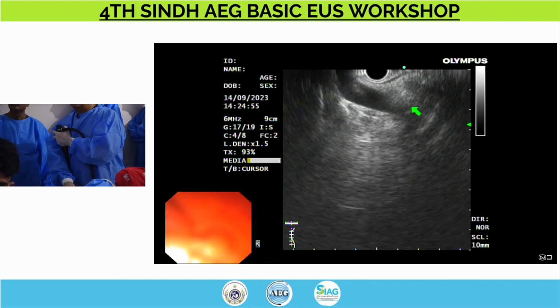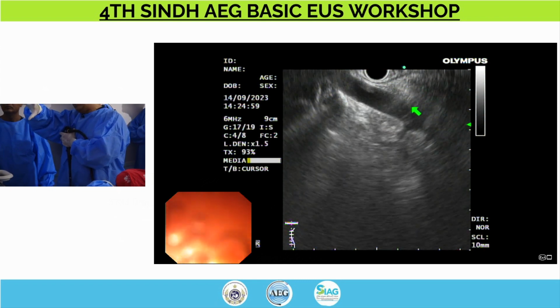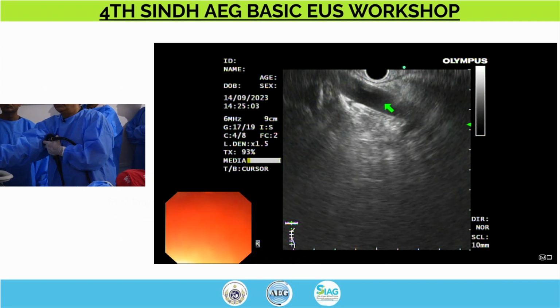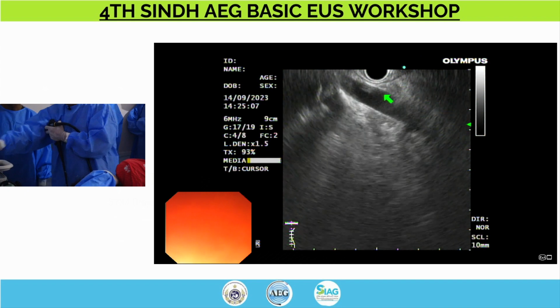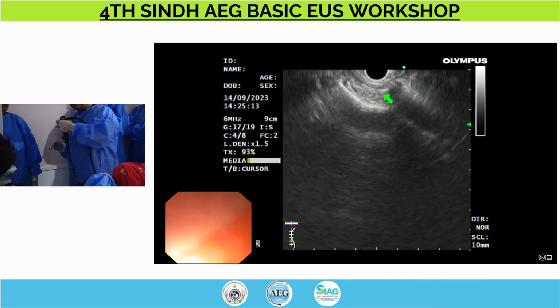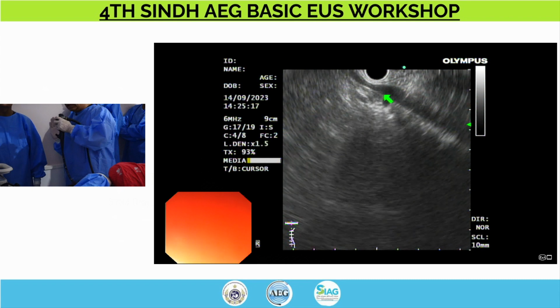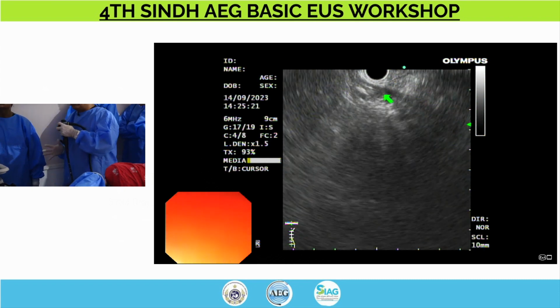Aorta is the structure which is in the middle of 5 structures. The way you can tell it is aorta, it's a tubular structure, and really I'm not able to compress it. My scope position is like this right now. Scope is straight. If I go to the left, first thing I will find is the IVC, easily compressible. You can see that where the arrow is.